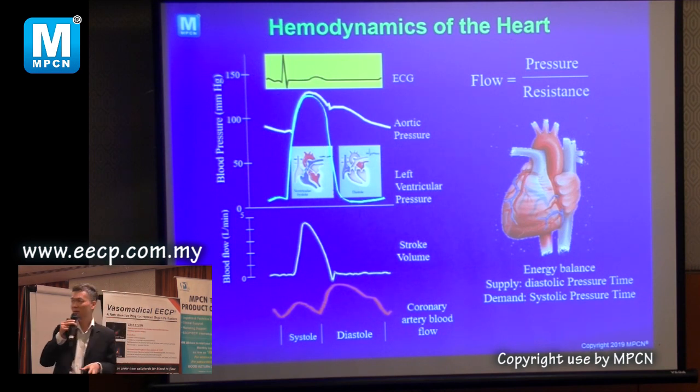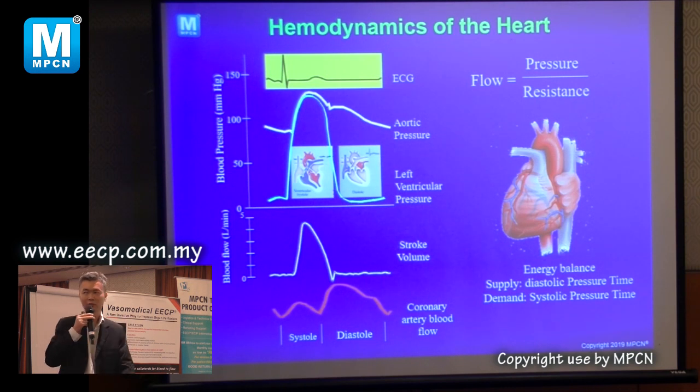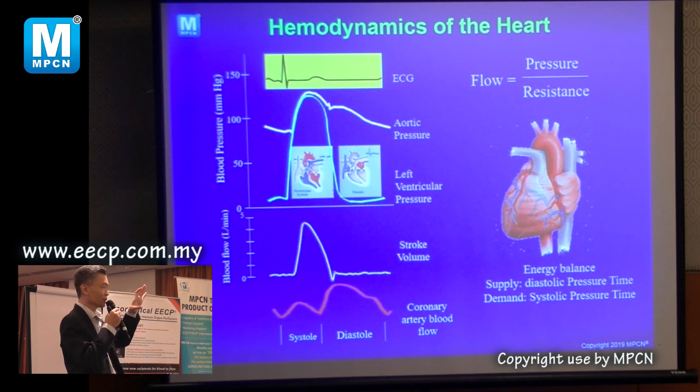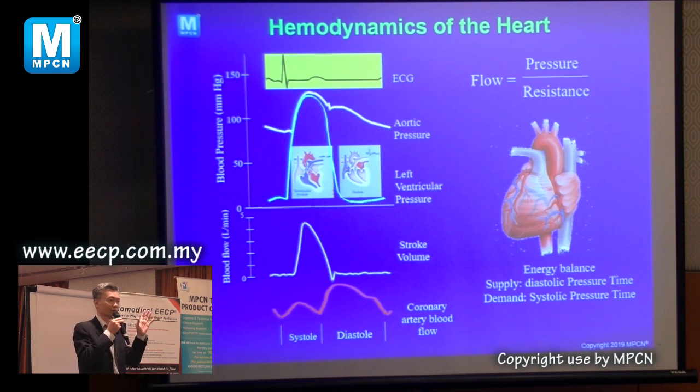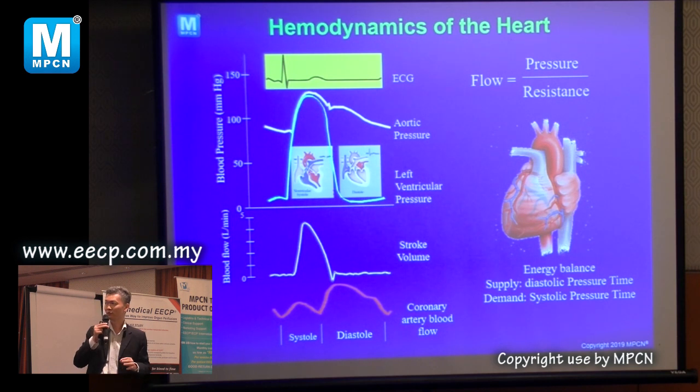To prevent this, you must make sure that the machine can detect when the heart is contracting and when it's relaxing by looking at the ECG. This ECG is very basic and very important. You must put it so that the QRS is big. If it becomes small, the machine becomes very confused about contracting or not contracting, and then it can cause harm. So that's important. The second, just below the yellow thing, is the pressure graph.